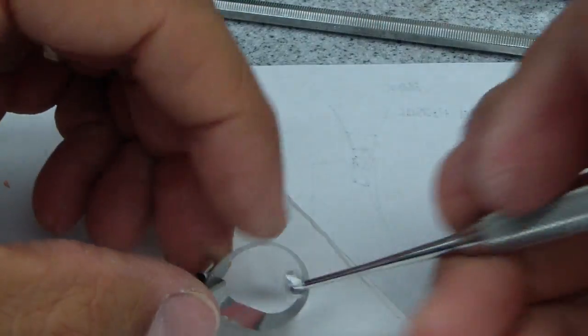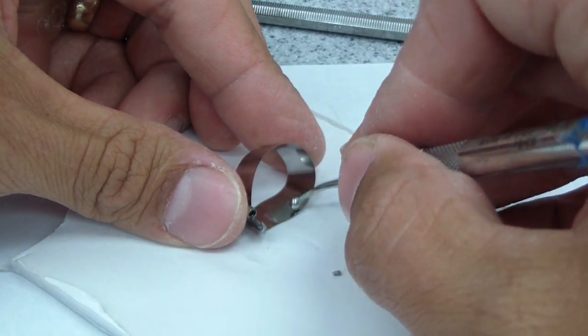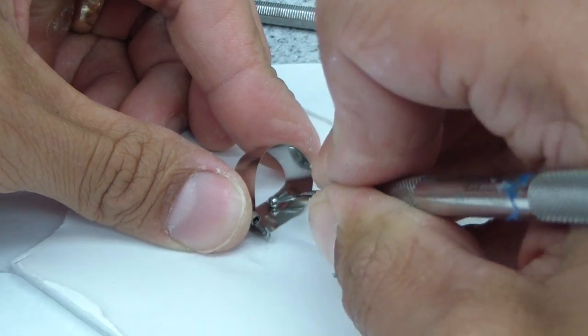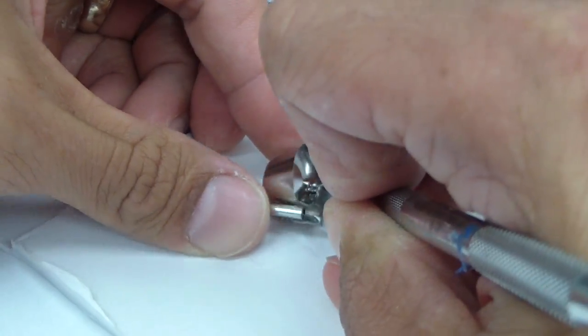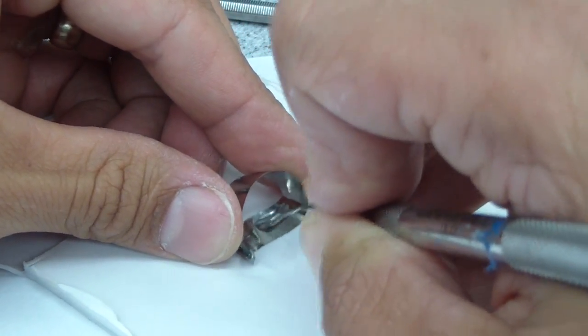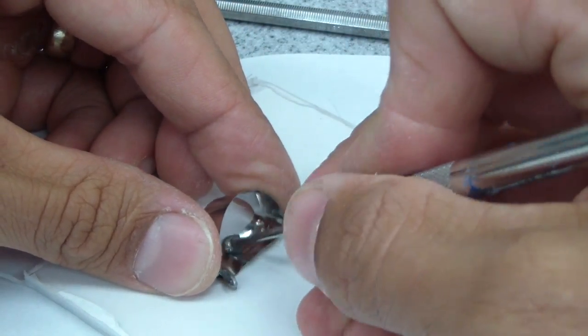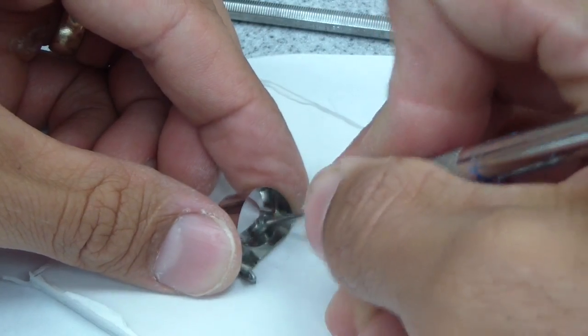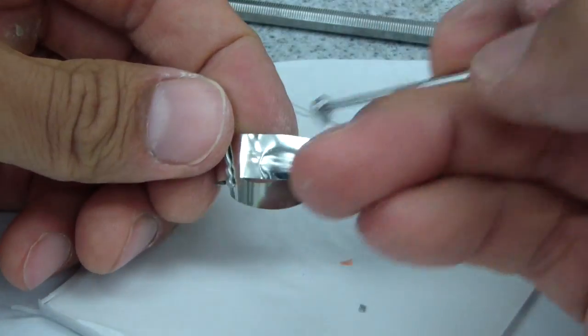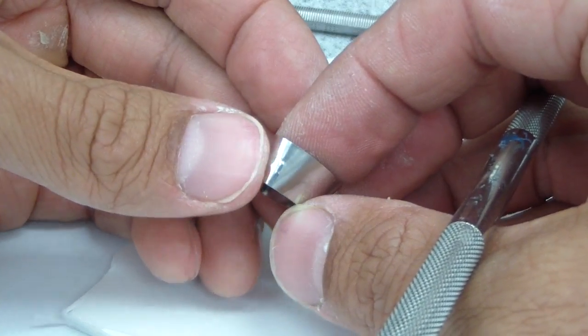Now with the auto matrix, same thing. Just sort of doing a chair side, lab bench. Same thing, picking the place where my contact's going to be and just developing it. So applying decent amount of pressure. And one of the problems now is placing the band because it becomes very stiff, especially in the gingival portion of the box. So it goes gently when you go to place it intraorally. So there you can see sort of that punched out shape. I'm going to smooth that off right here where it's sort of kinked. You can start to see that proximal contact contour.